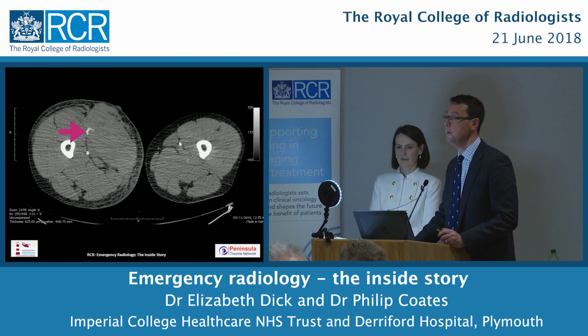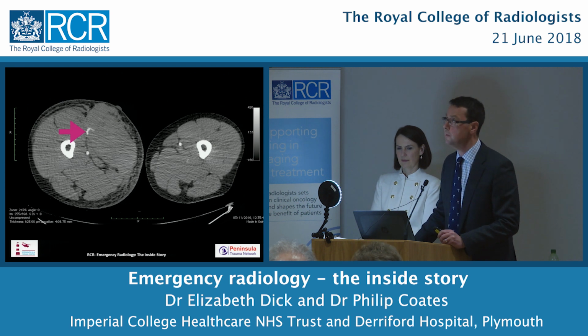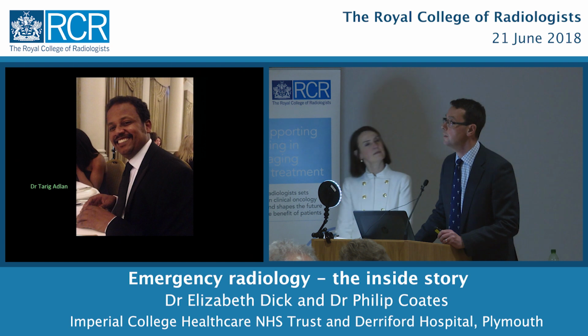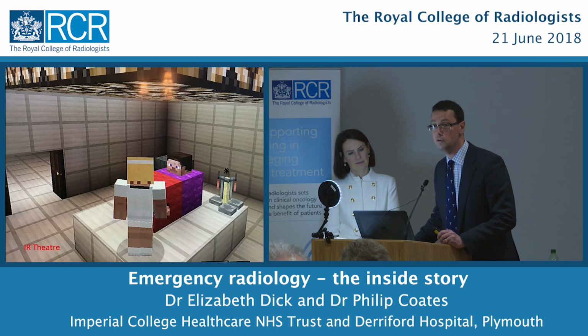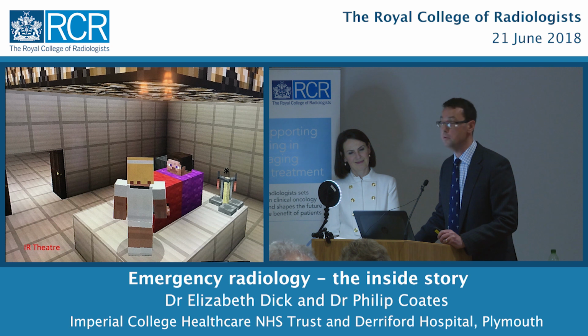Now the options for this chap, could he go to theatre? Well, it would be a difficult dissection with no definite chance of finding it, so that would be a difficult operation for a surgeon. So my colleague Dr. Tarek Adlan and myself, who's my registrar at the time, we took him to IR theatre, that's our Minecraft IR theatre, to operate on him to try and stop the bleeding point.